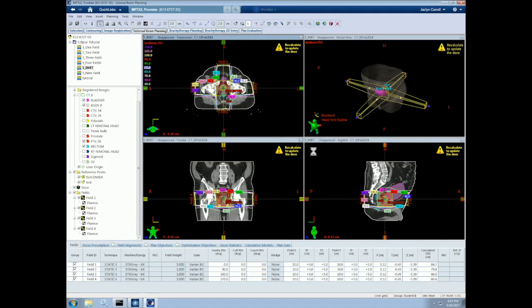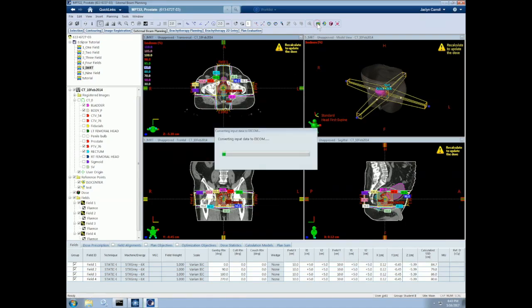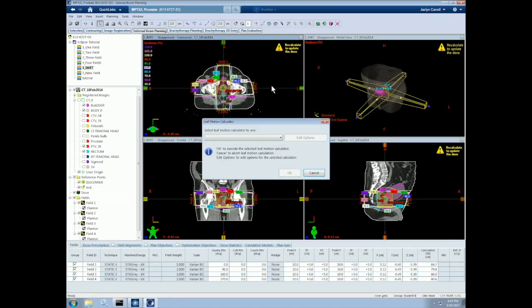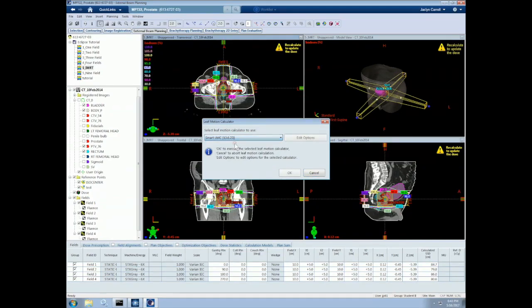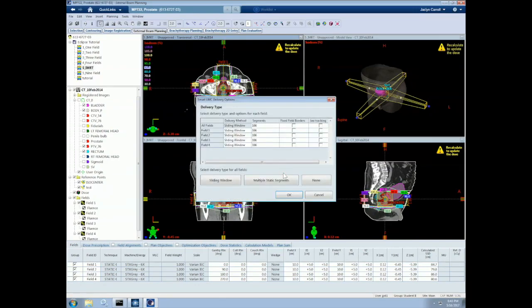Now that our optimization is done, we must calculate the dose to obtain our actual dose distribution. Let's click on calculate dose. We have to select the leaf motion calculator to use. We'll use the Smart LMC. Select OK. Here it specifies that all of our MLCs will be sliding windows, which is OK.